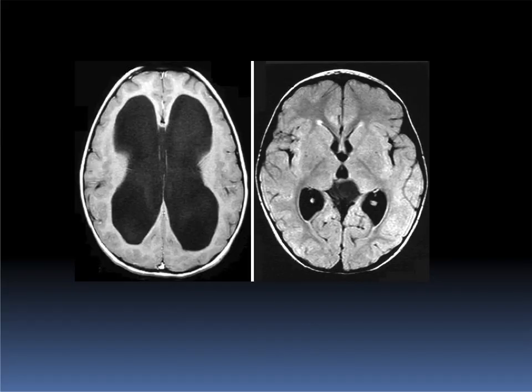In this image there is huge dilatation of the lateral ventricles on your left, and even on the right side there are diffuse abnormalities. The frontal white matter is abnormal, with loss of distinction between white and gray matter and dilatation of the CSF.